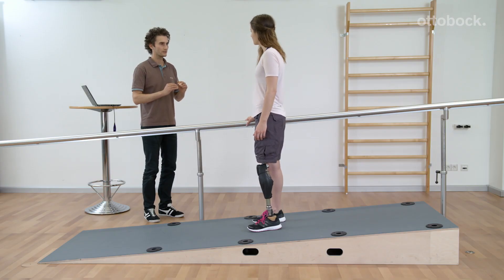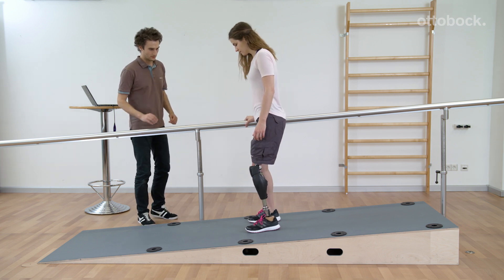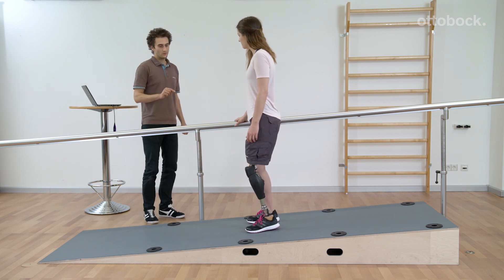Three criteria have to be simultaneously met to activate the intuitive stance function: the knee joint has to be flexed, not moving, and weight must be kept on the prosthesis. When all three criteria are met, it immediately blocks against flexion.